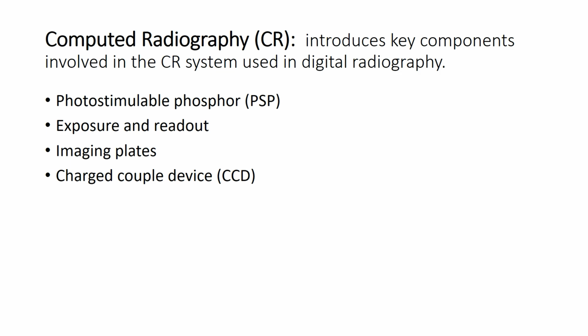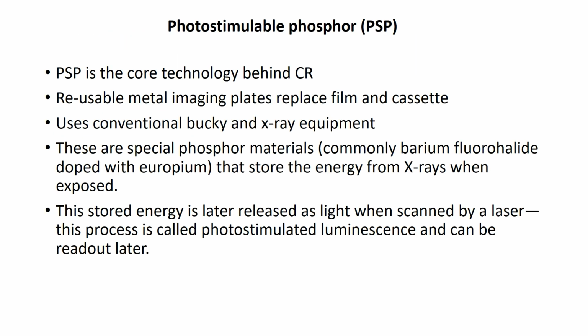We require exposure and the readout procedure, imaging plates and charge coupled device. These are the key components for the computed radiography system. Let us discuss each component one by one.